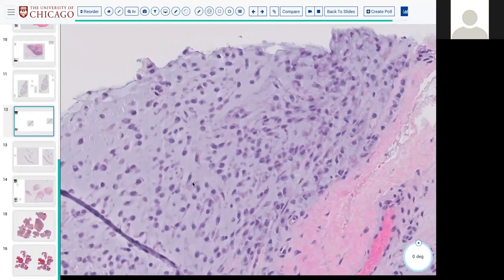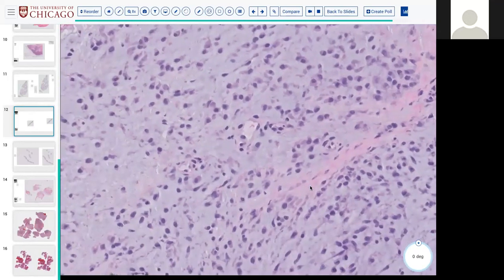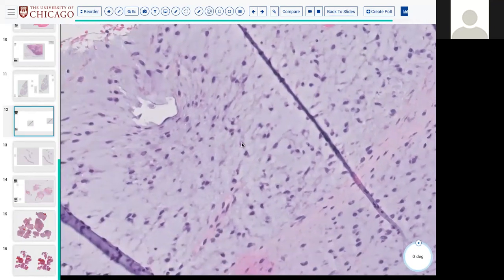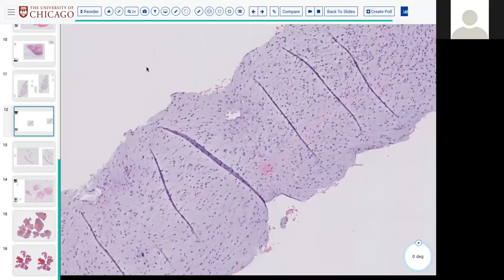Very little. It has this sort of mesenchymal look, these spindly cells embedded in a very, very myxoid background. I think these tend to be in the deep soft tissue of adults. I always get them confused. There's the mesenchymal one, which is for the head and neck, younger men, I think, so I don't think that's it. But the myxoid one has that characteristic NR4. I always think of the NRA, like a gun-toting guy with a pistol in his back pocket. That's how I remember it, deep and proximal.